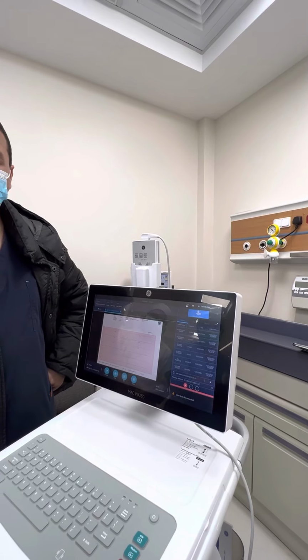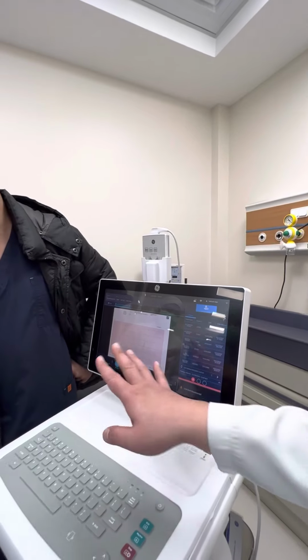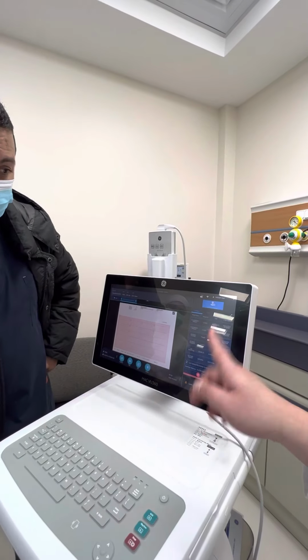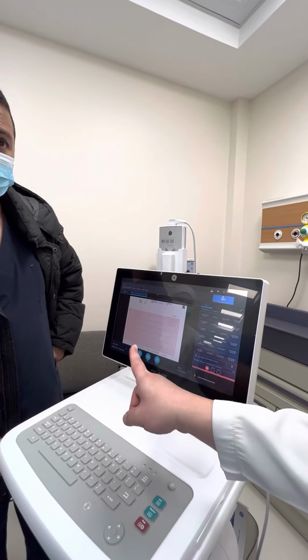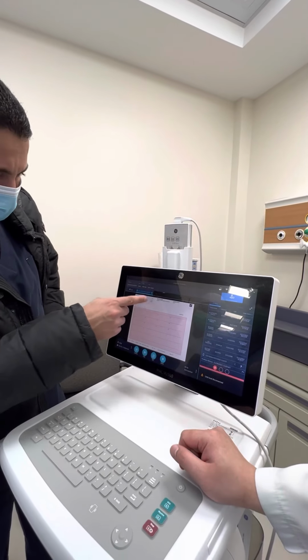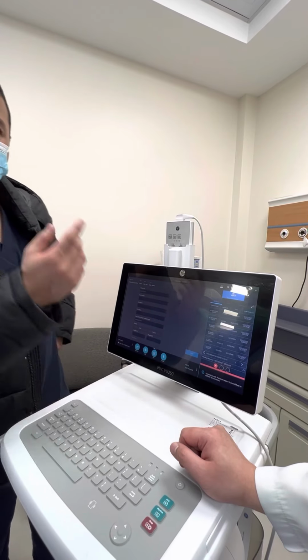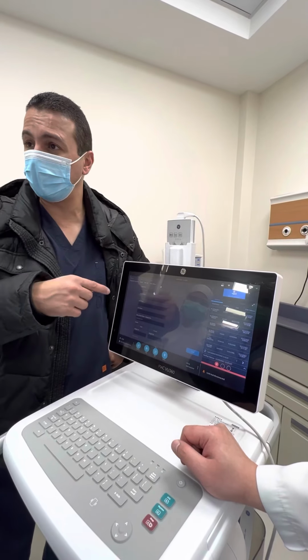Especially for the triage patient, I think that will help, so we do not transmit all the reports. Sir, can you give us an example of a patient who has done an ECG and we want to attach it to the file? This patient doesn't have patient demographics, right? Yes, it's 111-222. I put a hint for myself that this patient will be admitted.